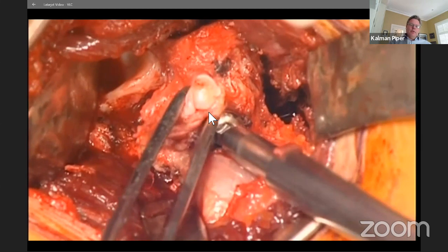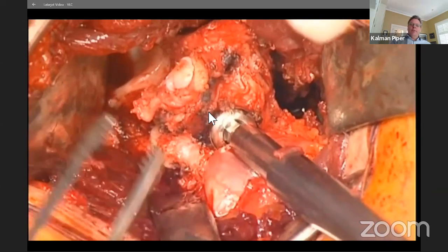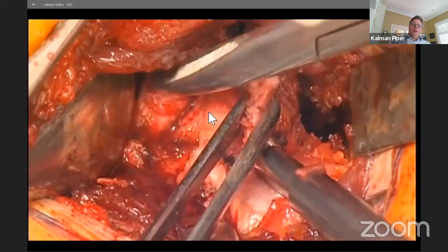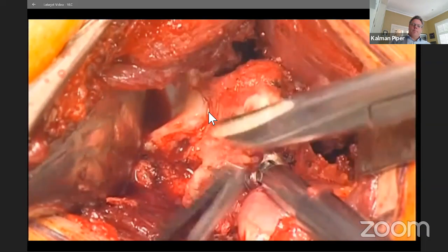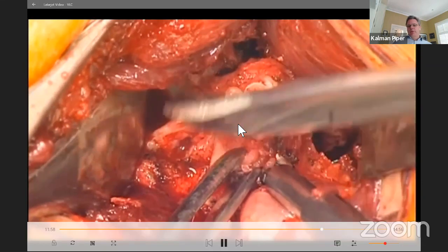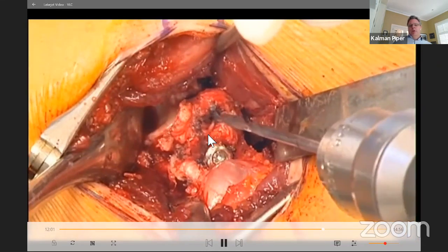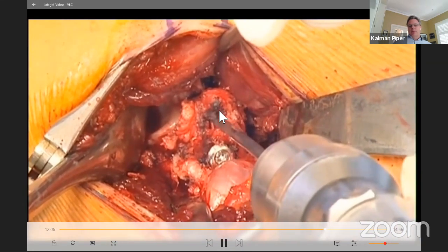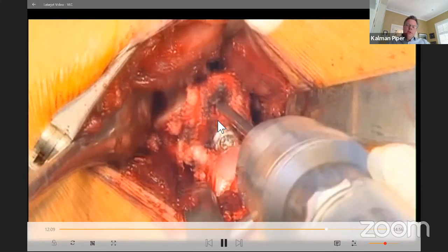So not too tight on that inferior screw just yet. You can still rotate that graft if necessary, but you're checking that the graft lines up with the articular surface. What he's holding there is the stump of the CA ligament, which will later be used to repair the capsule. He's happy with the position of the graft. He's now drilling the superior hole in the glenoid through the hole he's previously drilled in the coracoid graft.